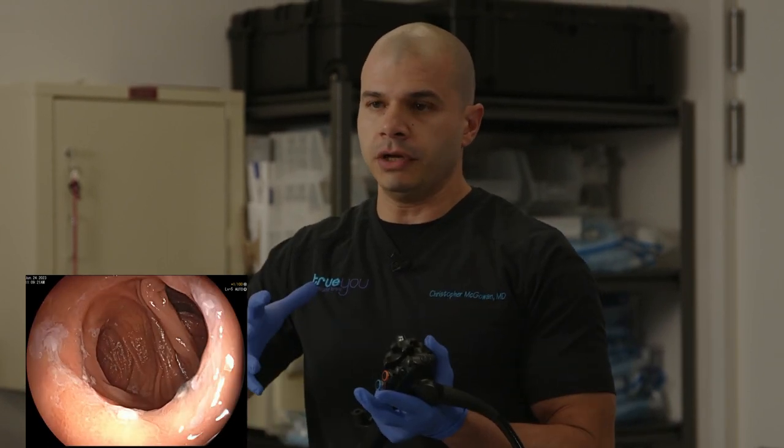So I've just entered, the patient's down the esophagus into the gastric pouch. So this is the patient's gastric pouch. And here is the anastomosis, or connection between pouch and jejunum, or small intestine. So when she had her bypass years ago, her surgeon recreated her stomach into a small pouch and connected it to the small intestine. But what's happened over time is that this has stretched out and dilated.